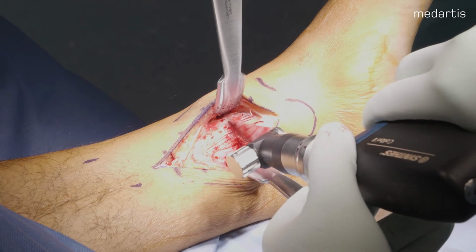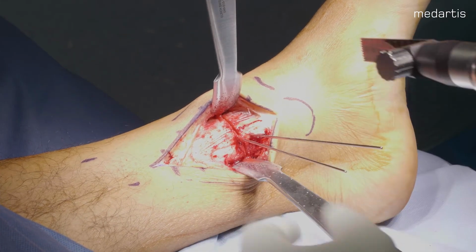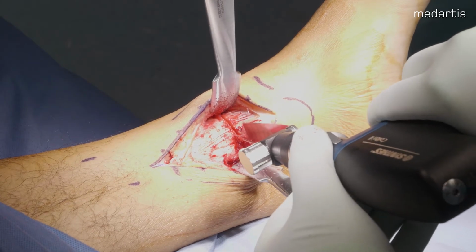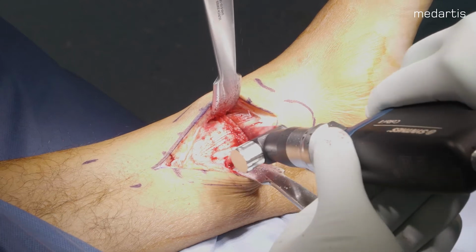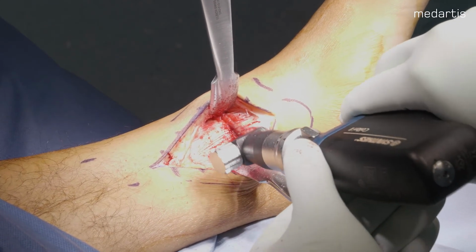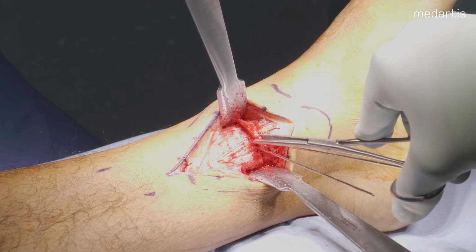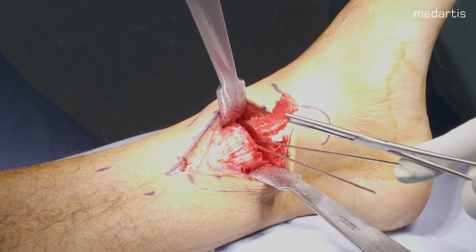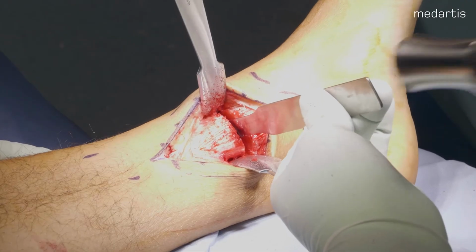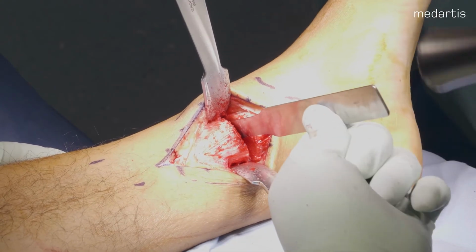An oscillating saw is used to perform the osteotomy along the K-wires, keeping the sagittal alignment of the cuts perpendicular to the anterior tibia with care to avoid penetration through the far cortex. The bone wedge is removed, and osteotomes are used to complete the anterior and posterior parts of the osteotomy.